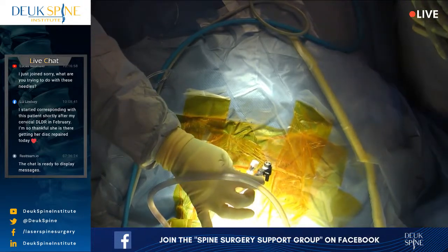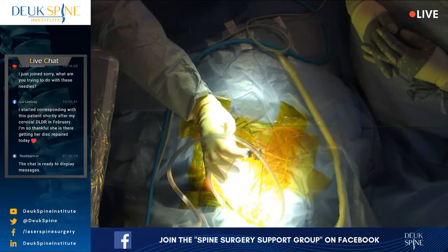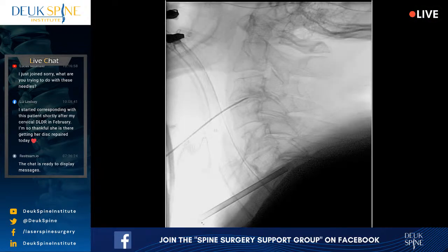So you can see the tube is now passed through the disc. And people say, well, aren't you damaging the disc when you're passing through it? The answer is no. The disc is already damaged. We're not damaging it anymore. We're actually spreading the jelly in the middle to the side, and then when we take the tube out later, the jelly will come back. So we're not doing any damage to the disc whatsoever. The only thing we've damaged in this surgery is the skin. We made a 4 millimeter incision, which is dramatically smaller than a fusion incision.